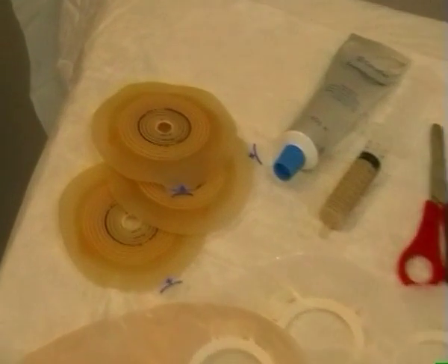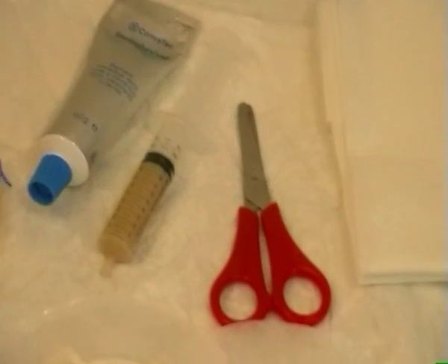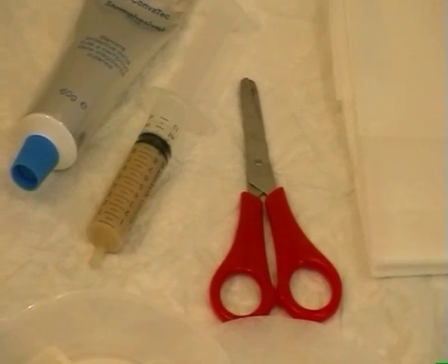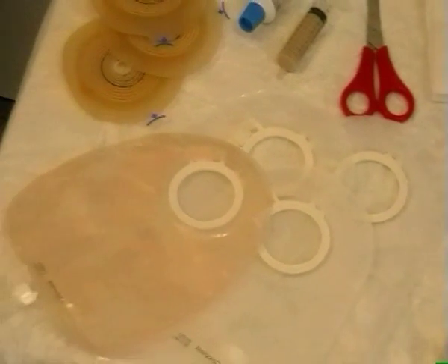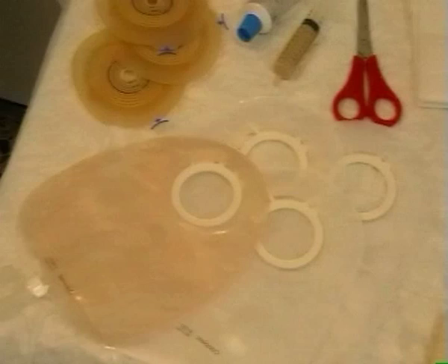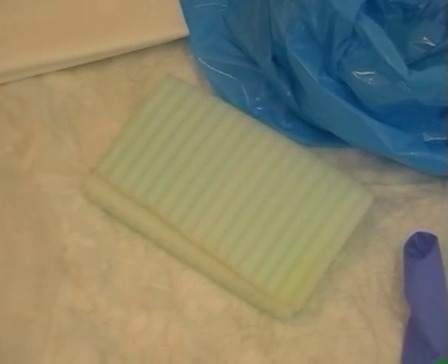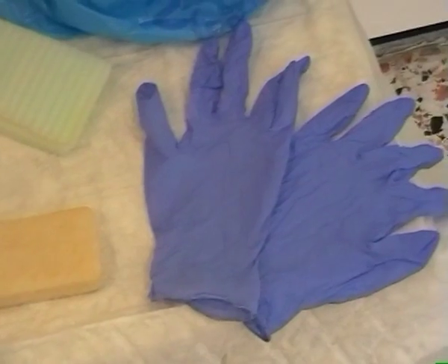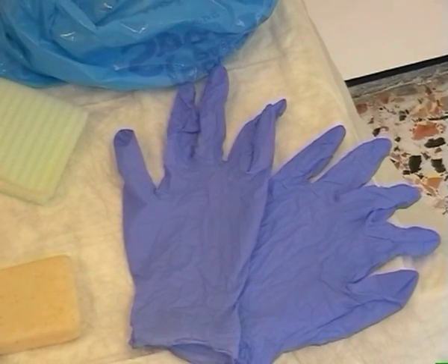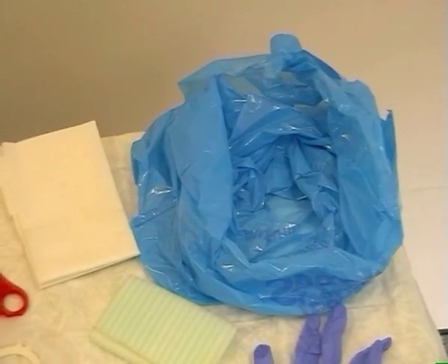Ecco il materiale necessario: placche, pasta protettiva, forbici dalla punta arrotondata, sacche di diverse dimensioni, spugnetta morbida, sapone neutro, guanti monouso, sacchetto per rifiuti urbani, e panno di carta morbido.